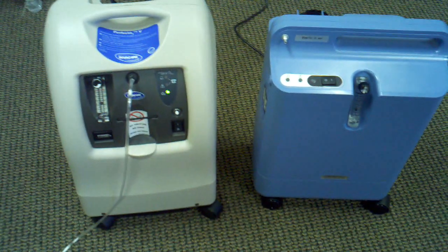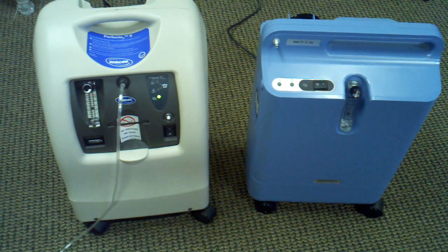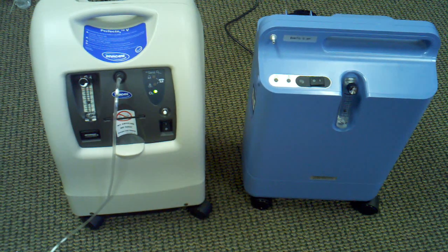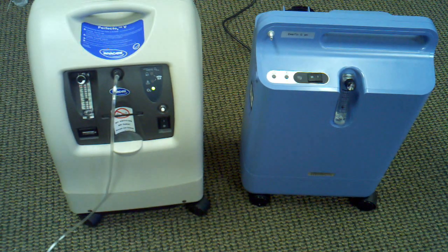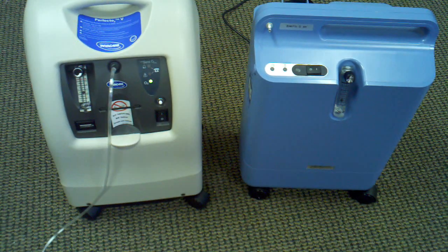So these are the two major concentrators that we recommend on our website. We appreciate you coming to it. If you have any questions, you can call us anytime at 866-730-1910. Thanks a lot.